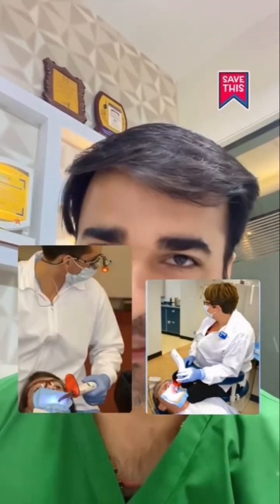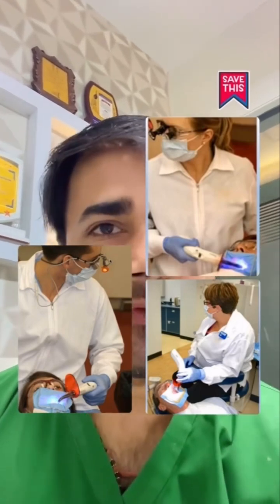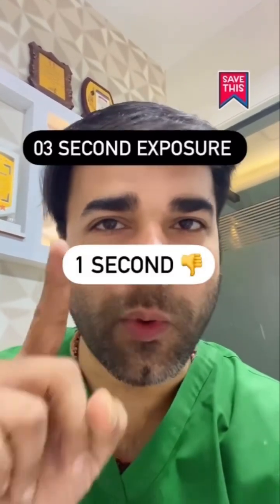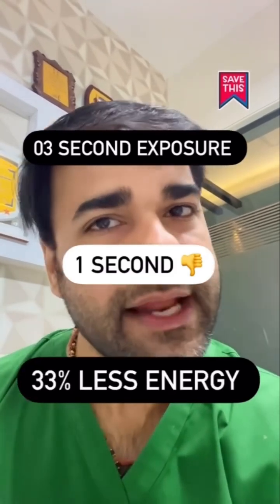For all those who believe in looking away while supposedly curing the resin — remember this: even the best curing light, if used improperly, will not cure the resin. In a 3-second exposure, if you miss the target for 1 second, it is equivalent to 33% less energy.